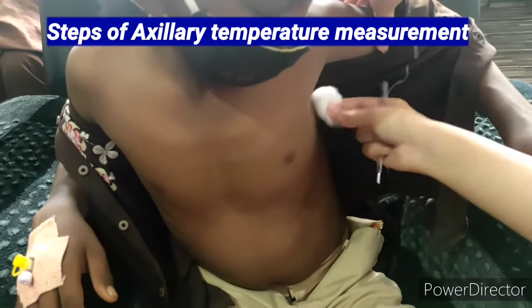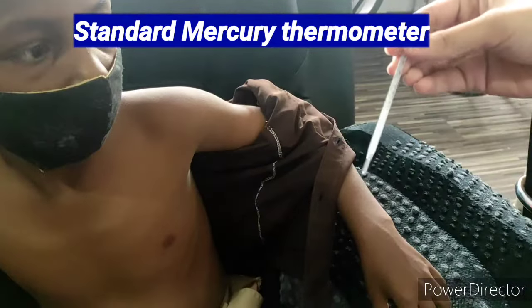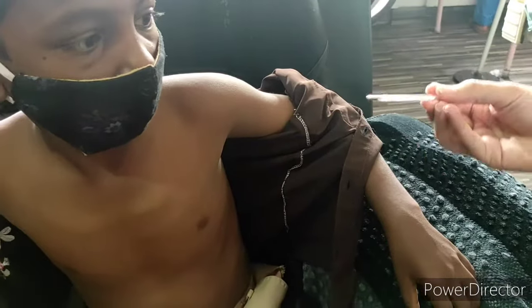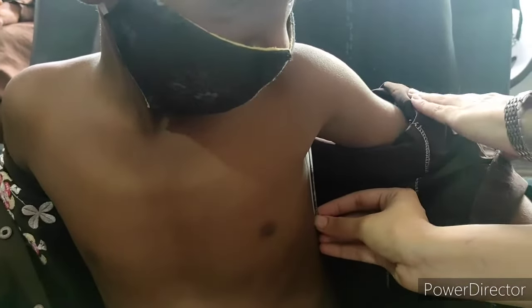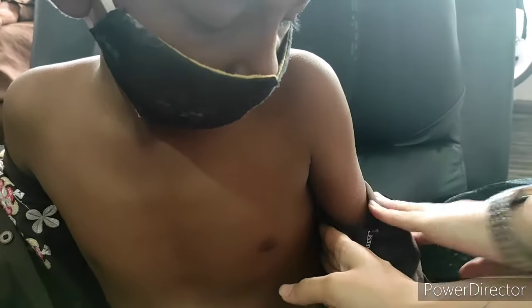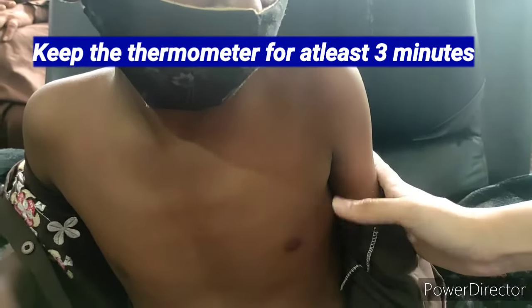First, I am showing you how to measure the axillary temperature. The first step is to dry the axillary area, then shake the mercury thermometer and put the tip into the apex of the axilla. It should be in touch with the apex of the axilla, and the arm should be in touch with the chest. Keep it for at least three minutes, then remove it and check the temperature.